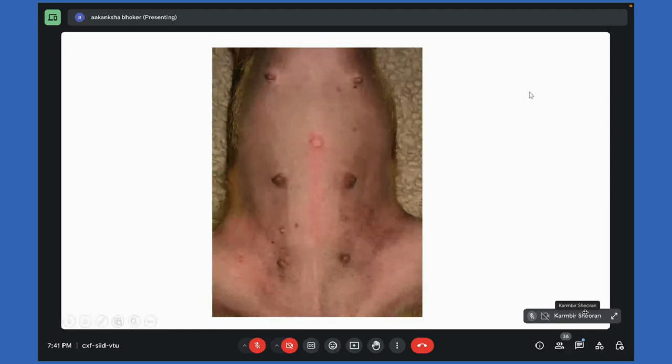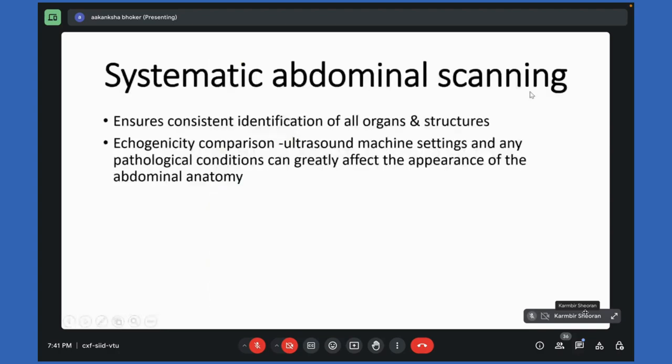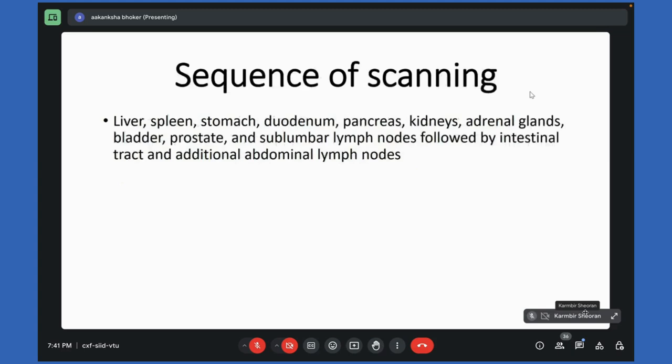So like that, we must have the area of anatomy, and we should perform the examination systematically. Every time we should follow a particular sequence so that we can better identify and do not get confused with any artifacts. Everyone can adopt their own sequence. This is one of the sequences from our textbook. However, I do not follow this sequence.